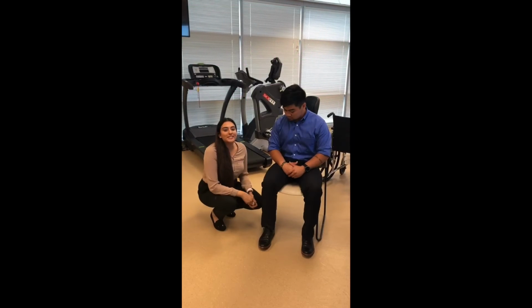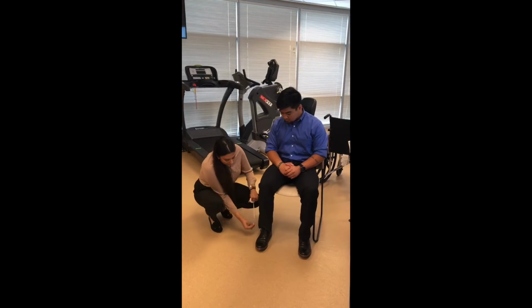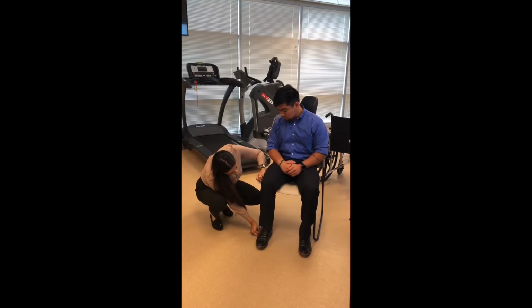So next we're going to do seat to floor height. So we're going to measure from the sole of the shoe up to the popliteal fold.